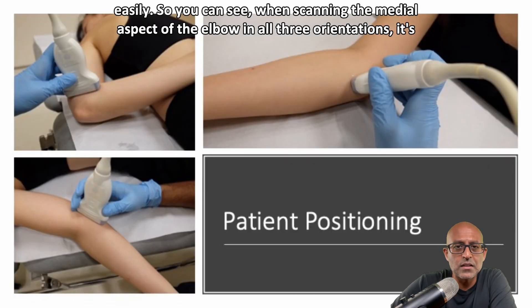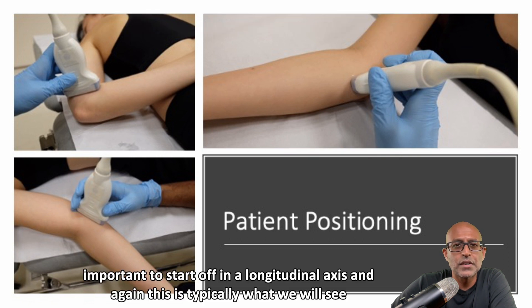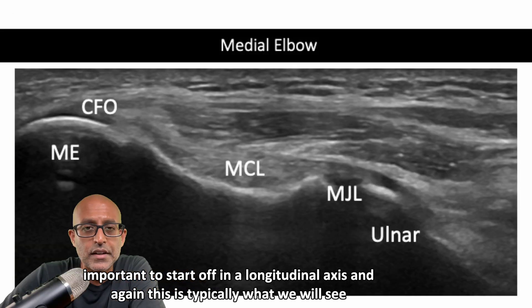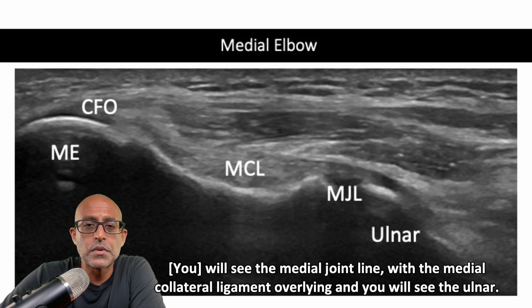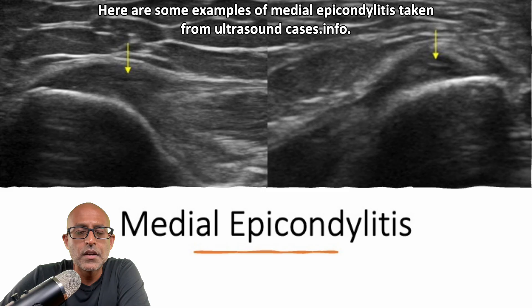When scanning the medial aspect of the elbow in all three orientations, it's important to start off in a longitudinal axis. This is typically what we will see: the medial epicondyle with the common flexor origin overlying, the medial joint line with the medial collateral ligament overlying, and the ulnar.